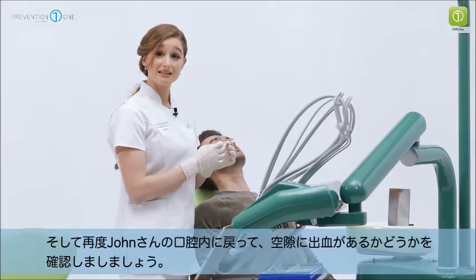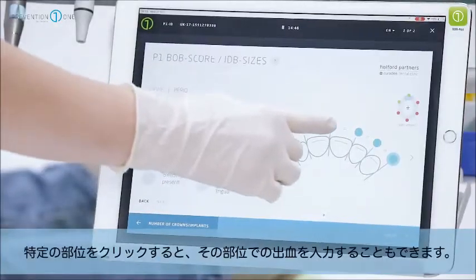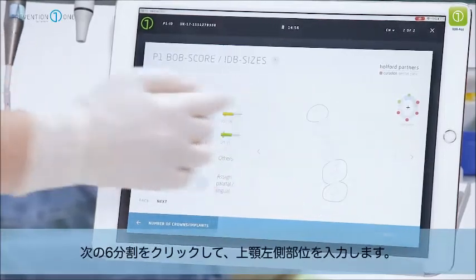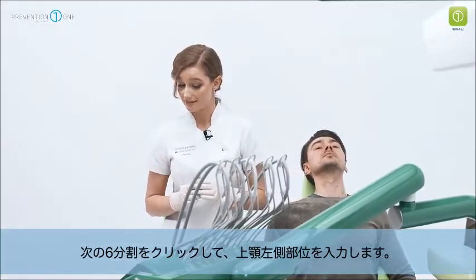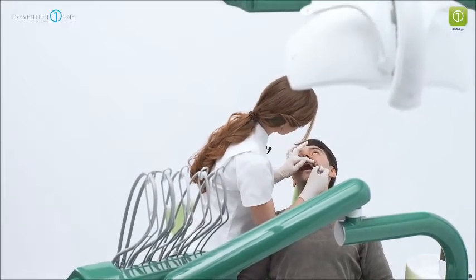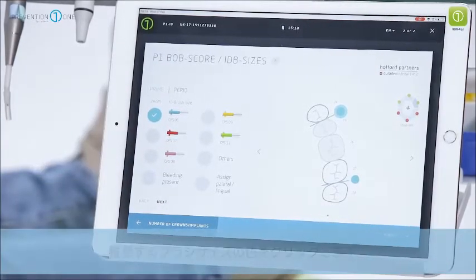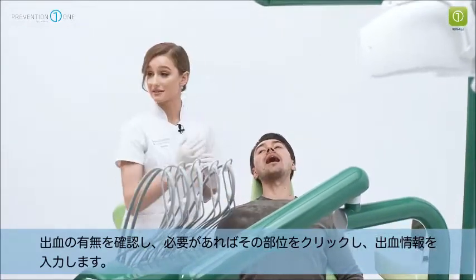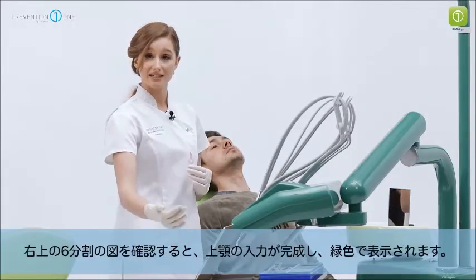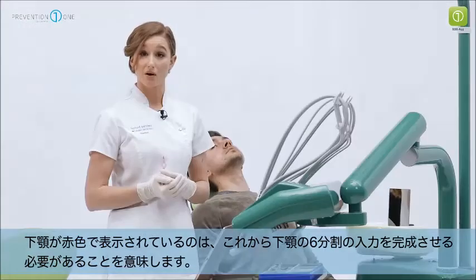I refer back to John to see if there is any interproximal bleeding. John has a little bit of bleeding in that sextant, so I place this by clicking the bleeding present button. I then continue to the next sextant by swiping or clicking the arrow. I place the turquoise brush again and refer back to John to check for bleeding, clicking the brush area to input any bleeding. Moving to the upper left sextant, I click the brushes needed and input any bleeding present. The top right indicator now shows the upper arch completed in green, with the lower arch still red.